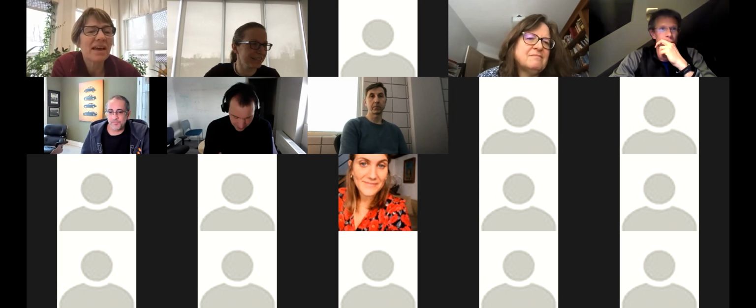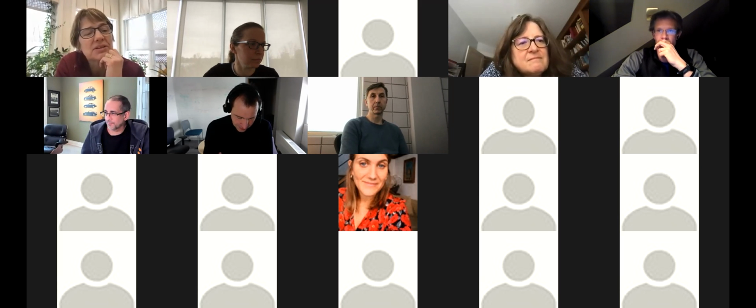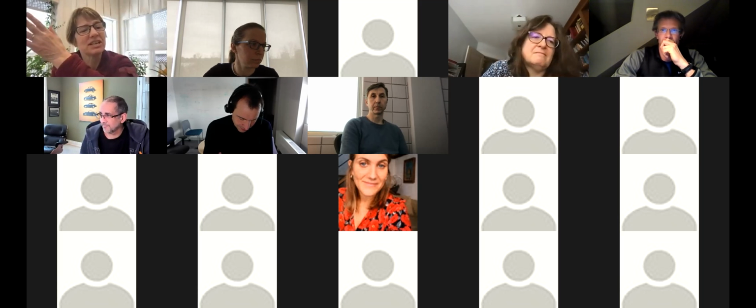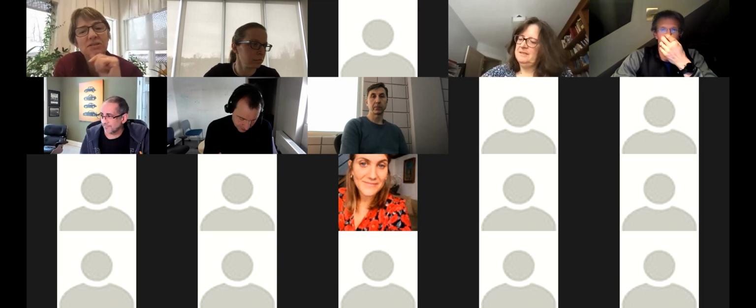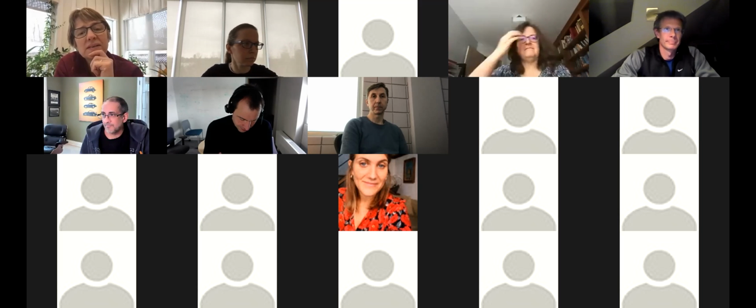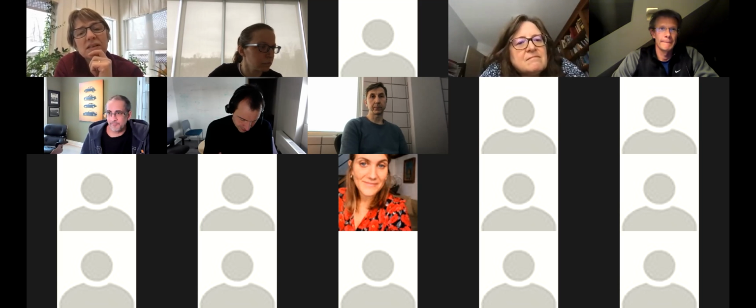Ingrid had a question. Ingrid has her hand up. Yeah, hi. I'm wondering if one is willing to accept a long TR. A lot of the work that my colleagues and I do is auditory, and we squirt in sound, try to get the brain into a steady state and image 4 seconds later, using a sparse design. There we can accommodate relatively long TRs. Does that help with the resolution compromise? Can we go for smaller voxels with a longer TR?